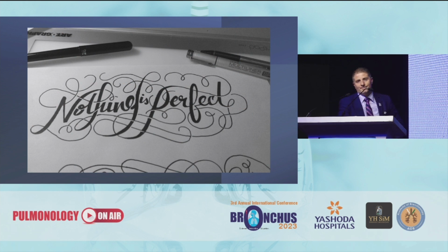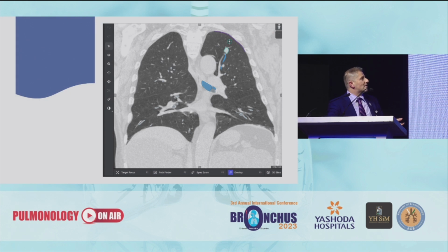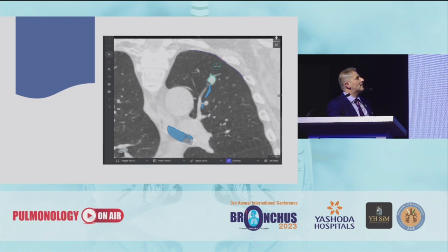But nothing is perfect in life. This is after we start that technique. We had some cases where the nodule was not in the pleura, and we thought that we are good. If it's even central, we'll get the signal. But that's not the case. For example, in this scenario here, you can see the nodule is not exactly touching any side of the pleura on the coronal or the sagittal. And in this case, you want to guide the surgeon by creating a signal coming from any closest pleura.